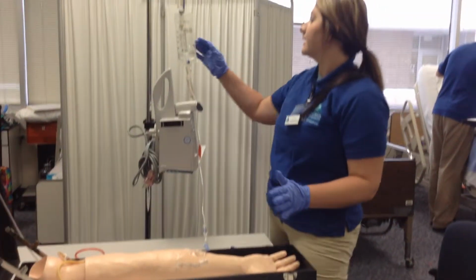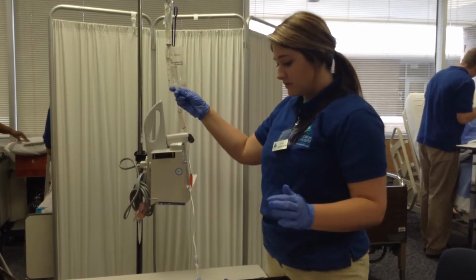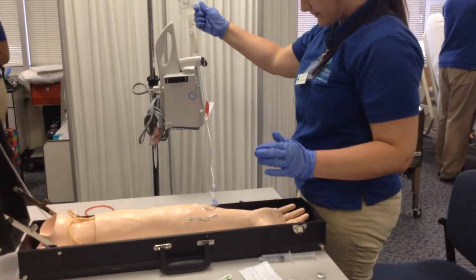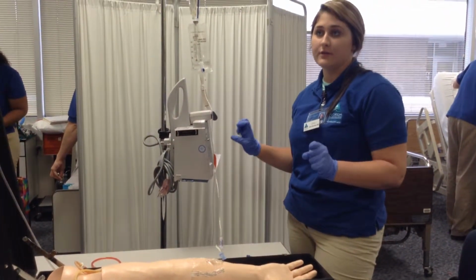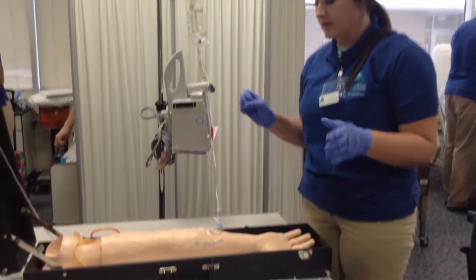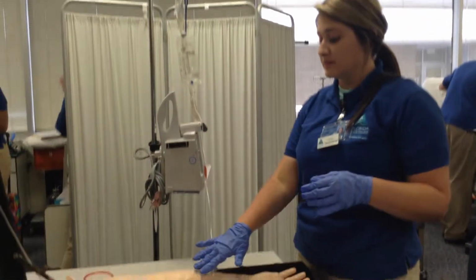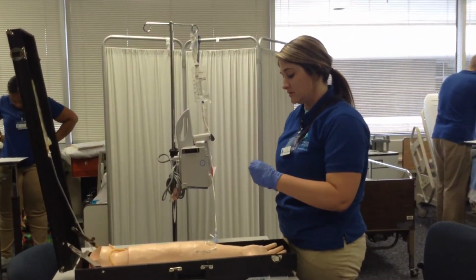I've already hung my mini bag up higher and my primary down. So now I will unclamp my mini bag. Then I would establish the flow rate for the mini bag, which is 17 drops per minute, which is what my math was. And I will observe the infusion periodically until complete. And then once I have begun it and the patient's taking it through well, I would unglove and then rewash my hands.